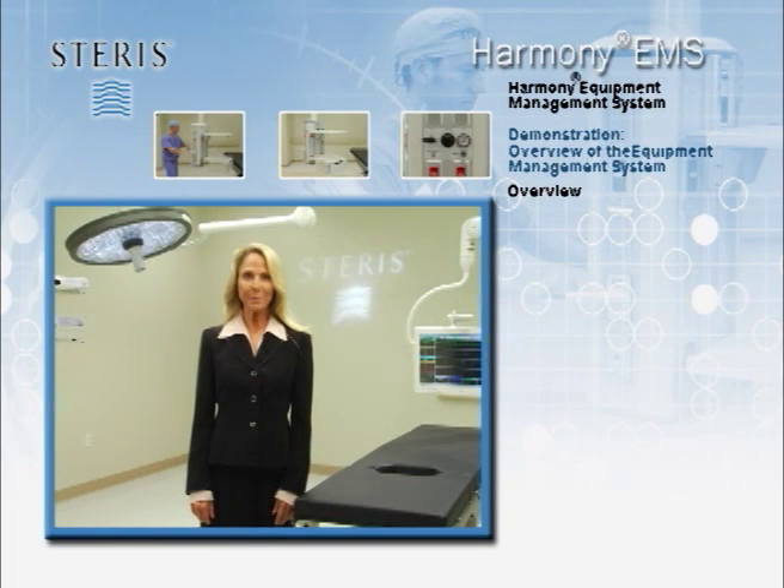The Harmony Equipment Management System, selected by your hospital, is an ideal solution to managing your equipment, gas, electrical and data service needs. The Harmony EMS units remove all trip hazards from the floor by centralizing all gas, electric and data services on a service unit that is suspended off of the floor.